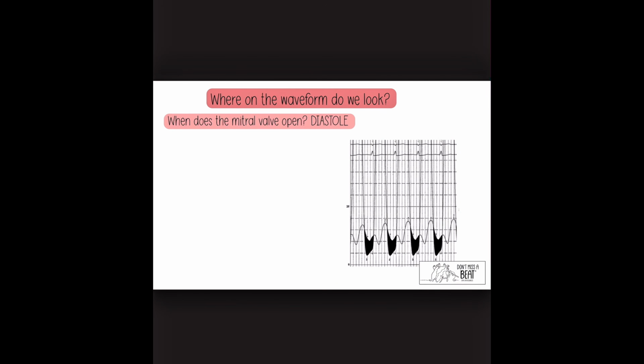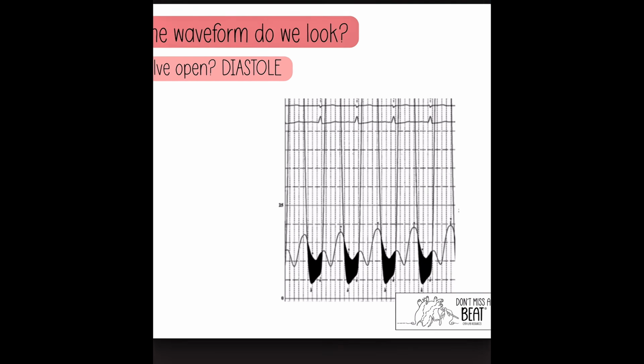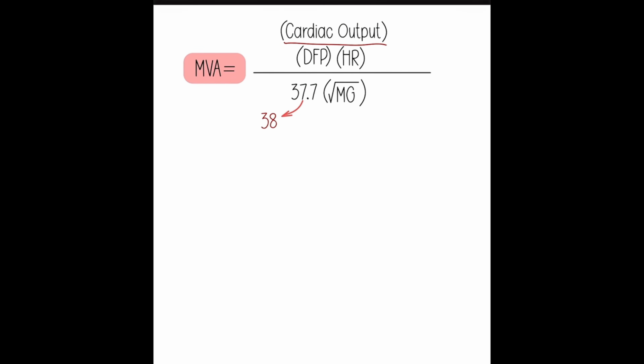Now, this is not something you can do peak to peak for. This is not something that you can sit here and really calculate an estimated gradient manually. You do need to snap it and get all of that information because it is just a little more difficult, and that's okay. So we're going to talk about how you're going to calculate it.